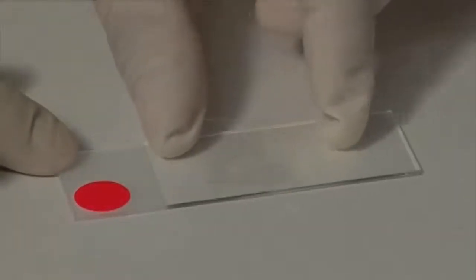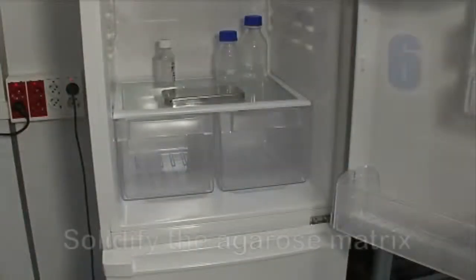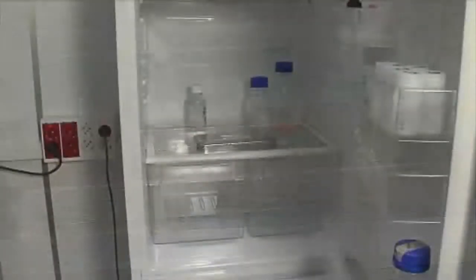Make sure to avoid the presence of air bubbles. Place the slide on a cold surface such as a metal plate and introduce it in the fridge at 4 degrees for 5 minutes so as to solidify the agarose gel.